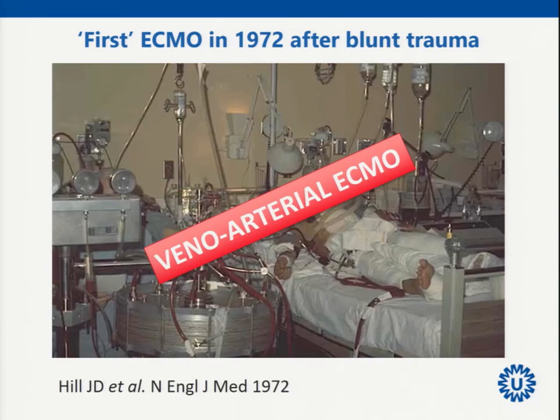Whereas at this point in time, we consider VA-ECMO a good indication for circulatory and cardiac support, and the respiratory support is usually provided by VV-ECMO.